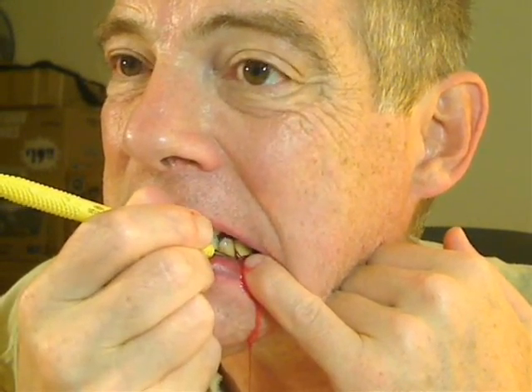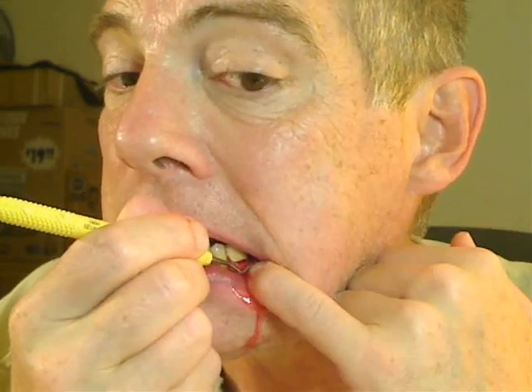Here is the issue: at some point, there is bone. The question is where? So what I do to deal with this is I don't make any sweeping judgments — I generally avoid trying to make sweeping judgments. I just focus on these things a little bit at a time. In this case, what I'm doing is I'm working the corner, gradually breaking this thing off. And when I'm all done, it'll be gone.